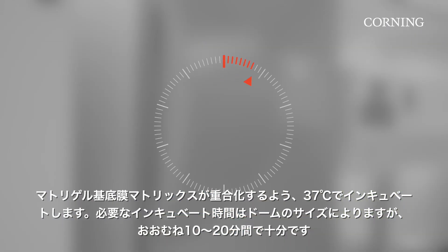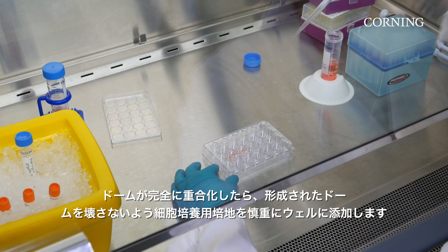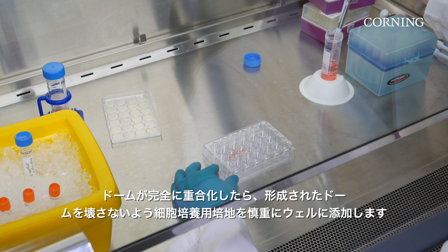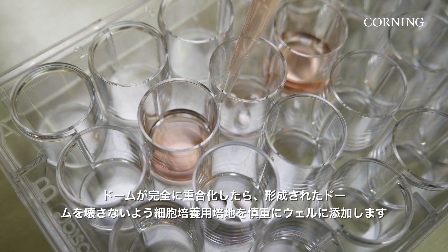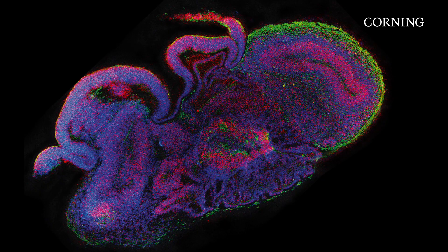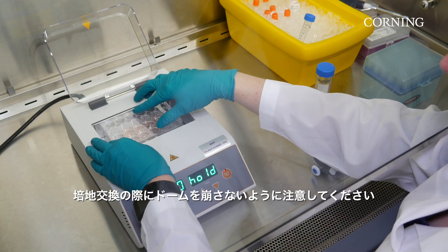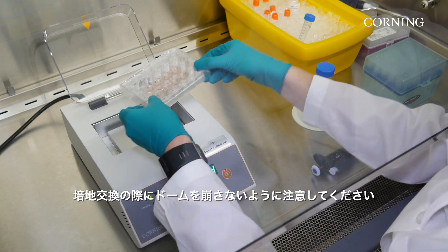Domes should be incubated at 37 degrees Celsius for the Matrigel Matrix to polymerize. The length of time required will be dependent on the size of the domes, but typically 10 to 20 minutes is sufficient. After domes are fully polymerized, carefully add a growth cell culture medium, taking care not to disturb the Matrigel Matrix domes. Culture organoids according to your protocol, and take care during medium changes not to disrupt the domes.